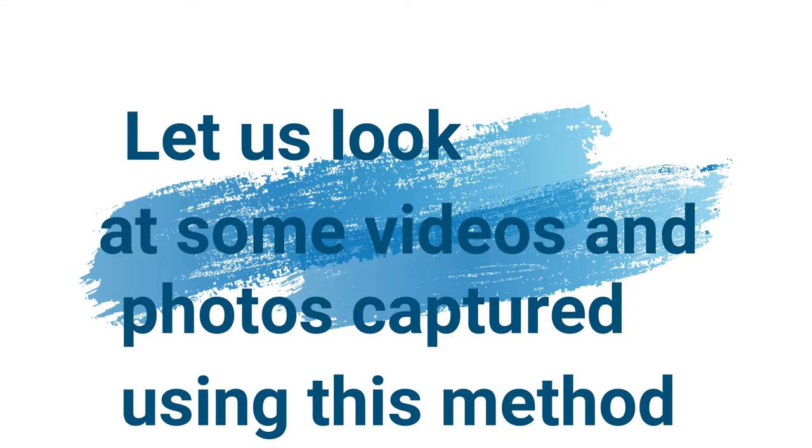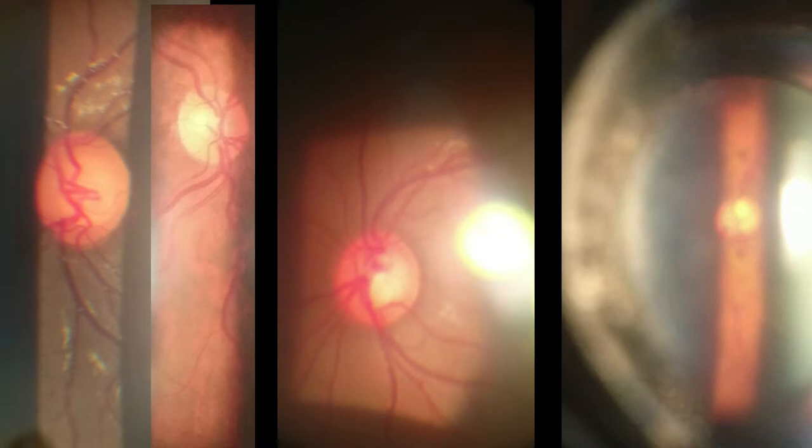On the left you see a cataract with particles on the anterior capsule. On the right, the anterior segment is being examined and now a 90D lens is placed. On the left you see the 90D fundus photographs of the disc.